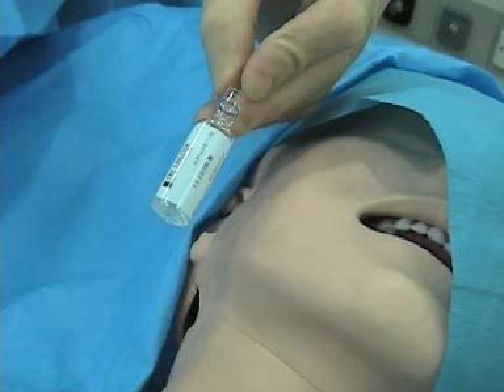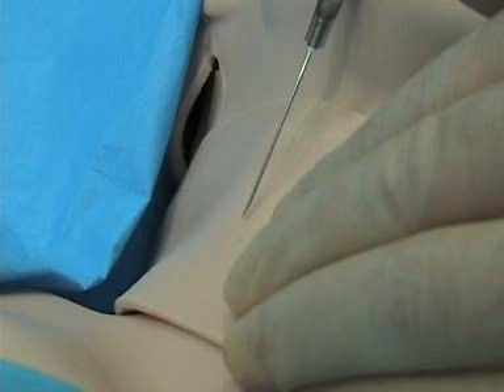If the patient is awake, use a little bit of local — this is uncomfortable. I think it's always a good idea to use a finder needle. Some people don't, but I think it's a good idea. I go with the old rule of, if this were my mother: if I'm going to hit big red and screw up, I would much rather do it with a small 20-gauge finder needle rather than an 18-gauge.